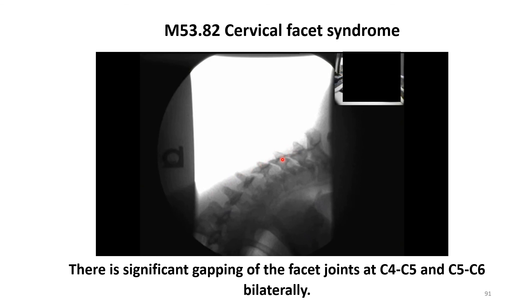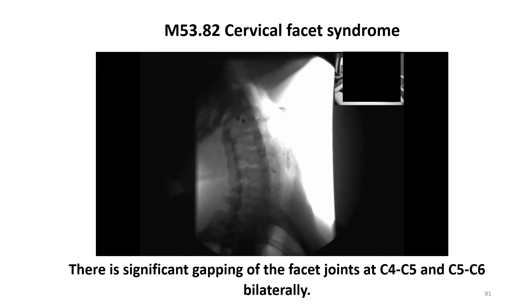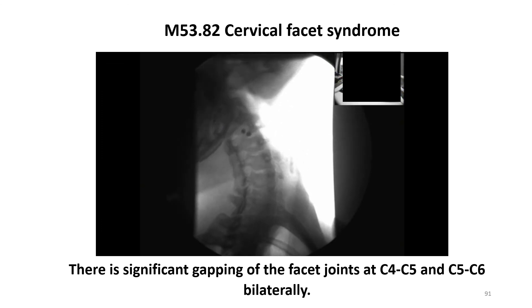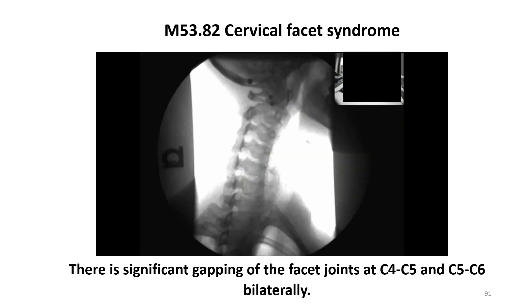The next diagnosis is M53.82, cervical facet syndrome. This patient has an ample supply of facet capsule injuries in three places on the study: the flexion and extension obliques, and the AP lower cervical with lateral flexions. The right posterior oblique shows significant gapping of the facet joints on the left at C4-C5 and C5-C6. Watching the mid-cervical spine facet joints at full flexion, you'll see significant gapping by the third rep — at C4-C5 and C5-C6, both are distracted and spread wide.